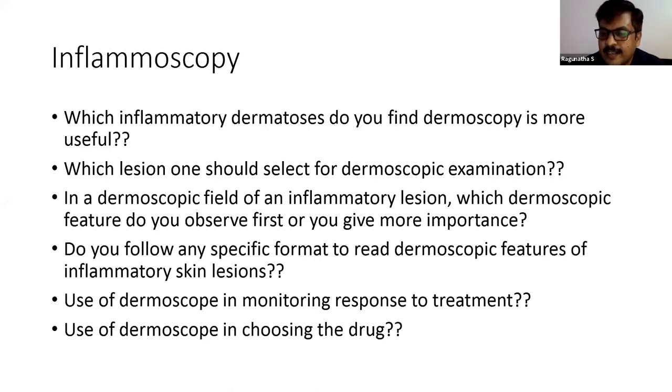Yeah, I totally agree with Dr. Enzo. For example, in DLE, when we see DLE under dermoscope, if you see red dots, it implicates the inflammatory phase of DLE, so we can give immunosuppressive therapy. When we see only white areas without any vascular patterns in DLE, there is no use of using immunosuppressives at that stage.